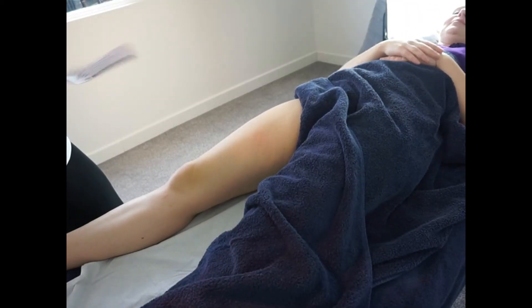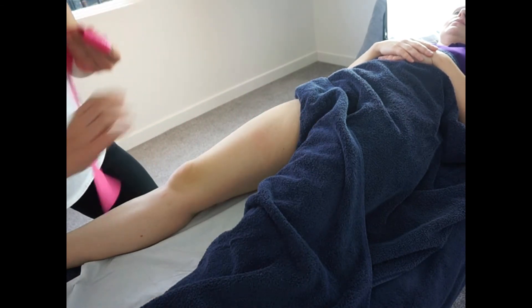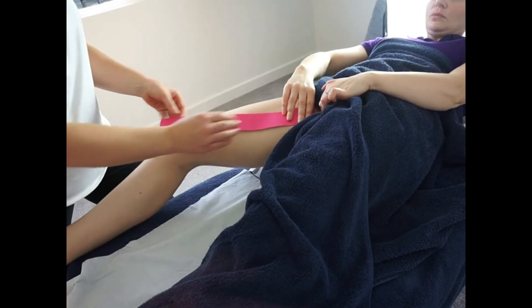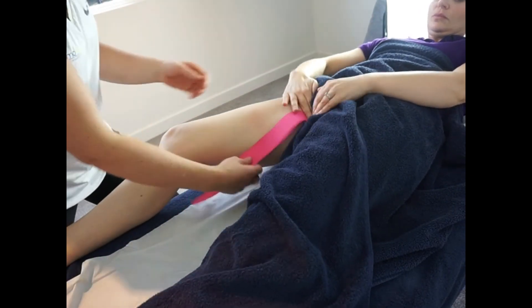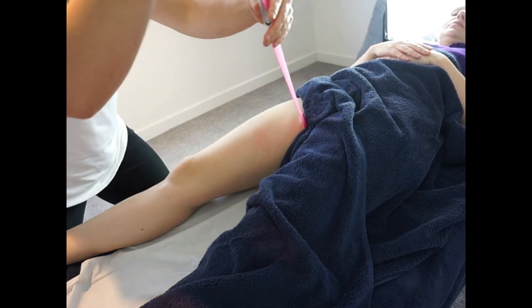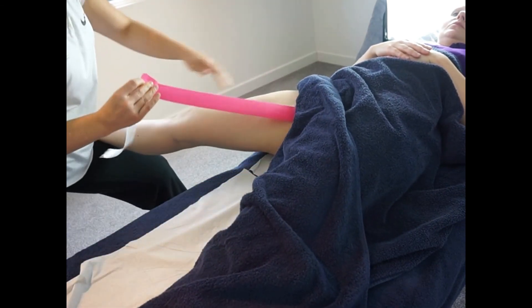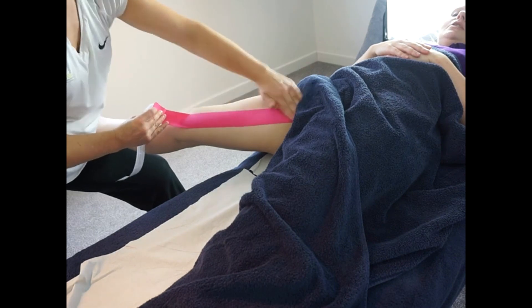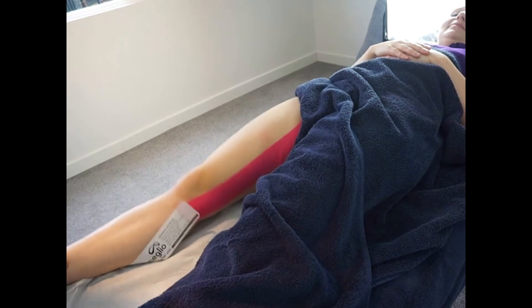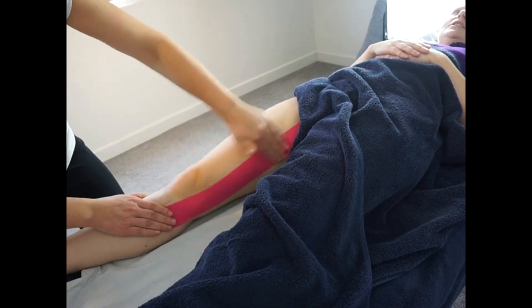For activation, we're going to anchor towards the midline of the body. Ask your client to place the anchor on the inside of their leg so they can get it quite high up onto the hip — anchoring on the inside of the hip and rubbing it well to stick. Peel back the active part of the tape, apply a light amount of stretch on the tape and also stretch on the tissue by bringing the leg into abduction. Rub the tape down well to stick, then simply anchor with no tension on the tape and no stretch on the tissue, rubbing well to stick.